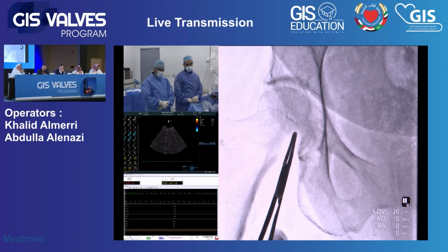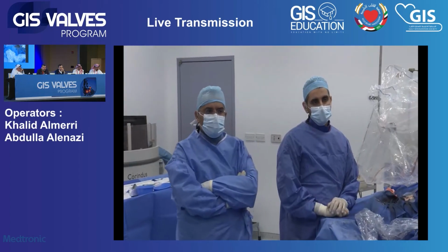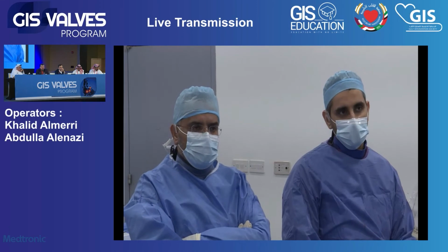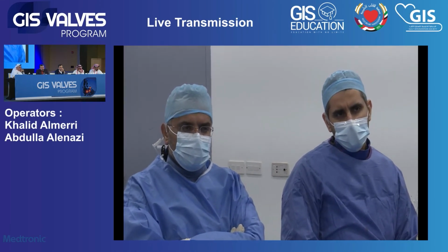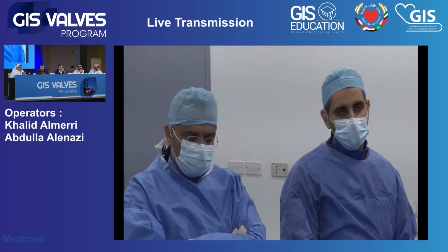You have used a temporary pacemaker. You are not using the other way, percutaneous or without a separate temporary wire, using just the LV guide wire for pacing? So maybe I respond to this question. We did use this technique before, a few times, but to be honest, we feel more comfortable with transvenous pacing. It's more reliable. And in many of these cases, you want to keep it for 24 hours in case the patient develops new conduction delays with the self-expandable valve. Some people like it. We've tried it before, but we feel more comfortable with transvenous pacing.